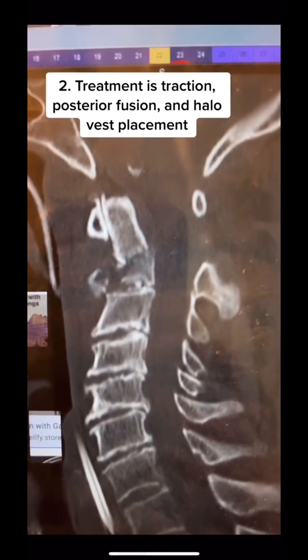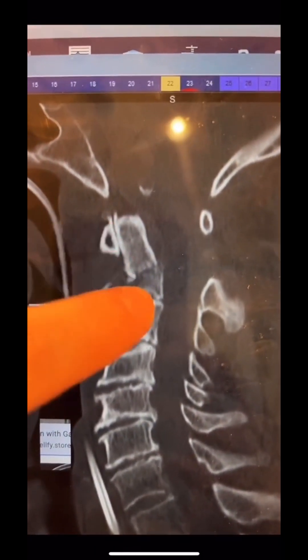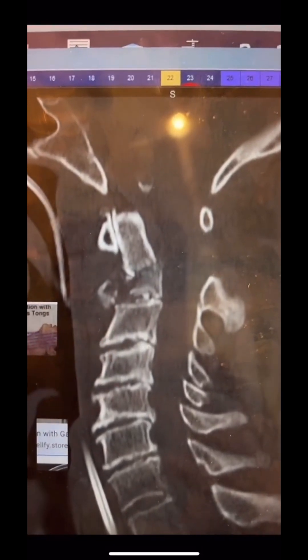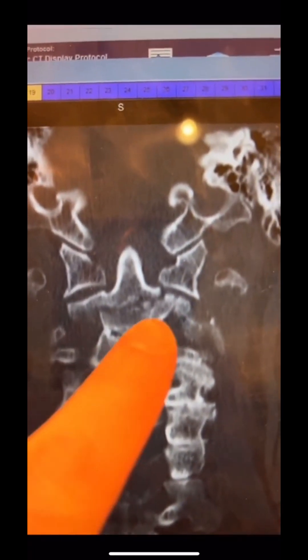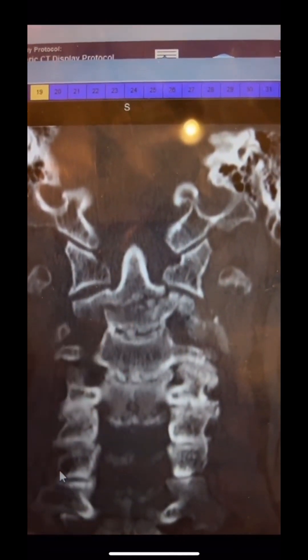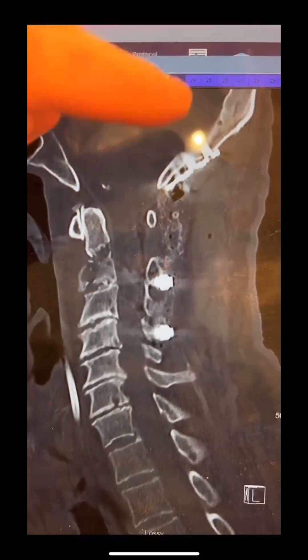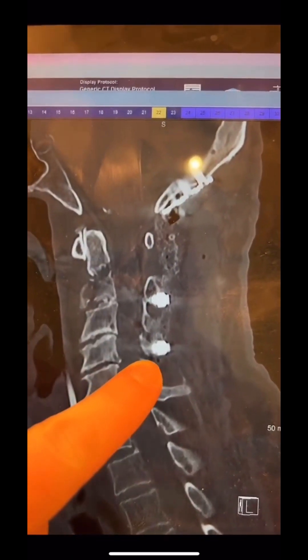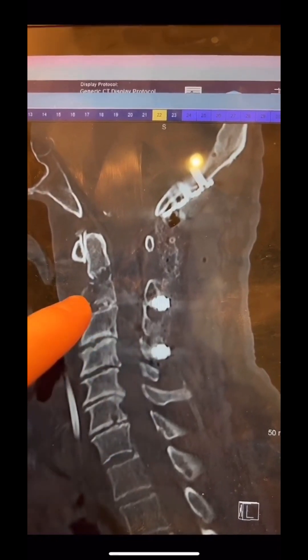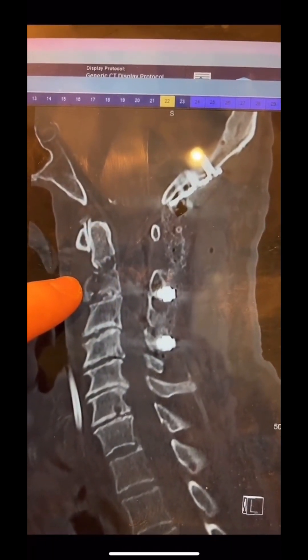Here is the CT in traction, and you can see that we got pretty good reduction of that fracture already with just a little bit of traction. On the AP CT, you can clearly see that this is a type 3 fracture. I was happy with the results of the traction, so we decided to take the patient to the operating room the following day for stabilization. Here is the post-operative CT where we fused the patient's skull base all the way down to the mid-cervical spine and got near complete anatomic alignment of the fracture.